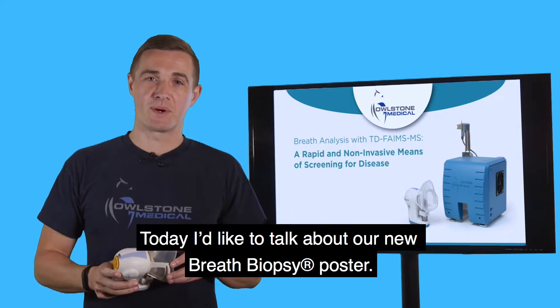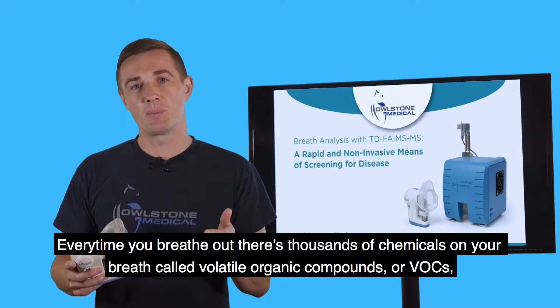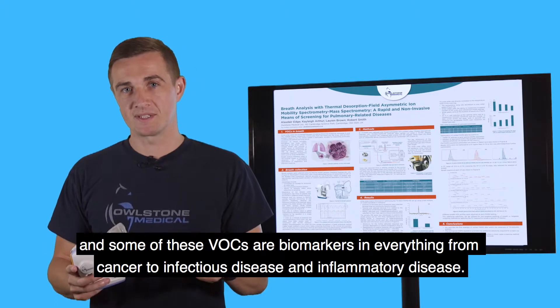Today I'd like to talk about our new breath biopsy poster. Every time you breathe out, there are thousands of chemicals on your breath called volatile organic compounds, or VOCs, and some of these VOCs are biomarkers in everything from cancer to infectious disease and inflammatory disease.